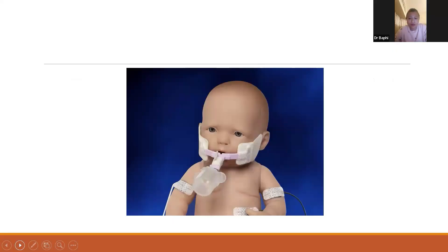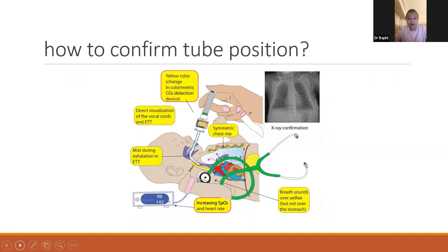This is the way we use the Neobar. A small, approximately half-inch plaster has to be encircled around the Neobar, and the endotracheal tube is attached along with it. One Neobar can be used for about five days and can be removed either by cutting it or by removal of the hydrocolloid tabs.